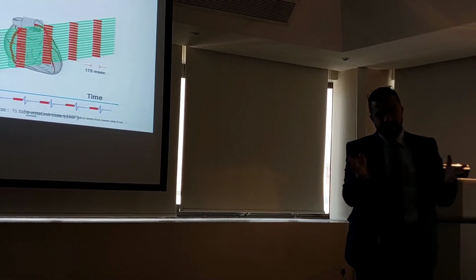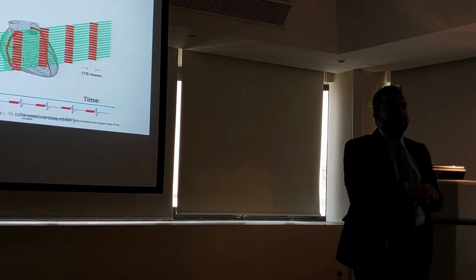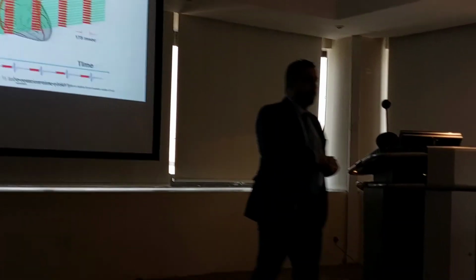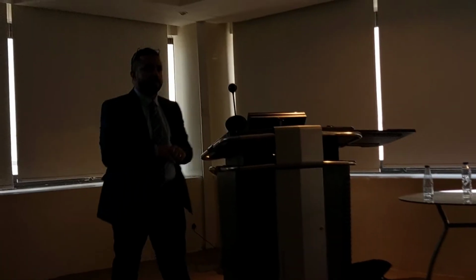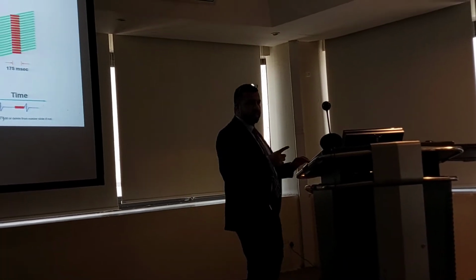75%, so diastolic. 75, 65 sometimes, okay? Clear? Sometimes you can get it to 70 to 80, but this is the best phase. So, do you have any questions, guys?